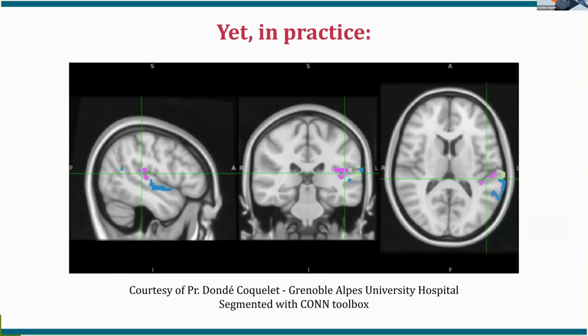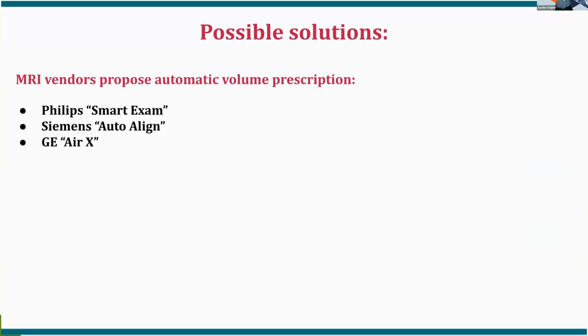So you have quite a big chemical shift. The region is quite close to the skull, so it's hard to avoid contaminations. And so both the accuracy of the geometry planning and the reproducibility were an issue. So we thought of solutions for that.